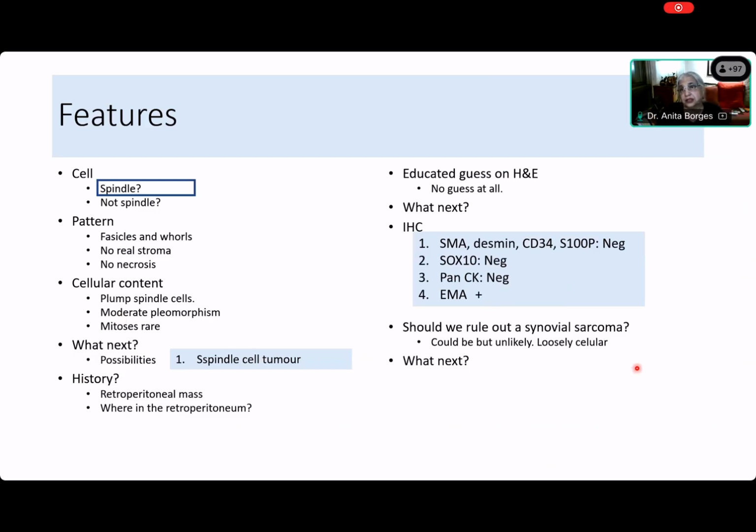So now what should we do next? We've done everything that we are supposed to do. Everything. SOX10, pancytokeratin, EMA, whatnot. So what should we do? When you're stuck, you go back to the drawing board. Or somebody says, do ALK. Well, not a bad suggestion, but just do ALK out of the blue? There has to be a reason to do ALK. So then we go back to the drawing board and look carefully at the histology.